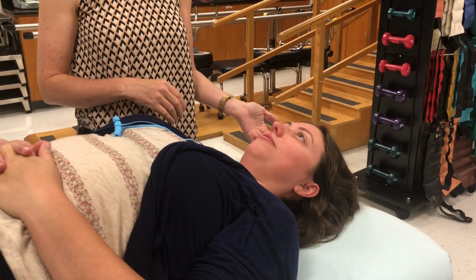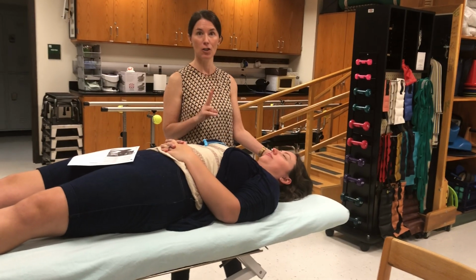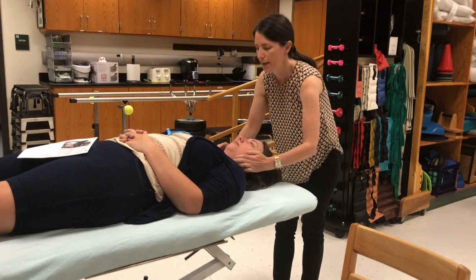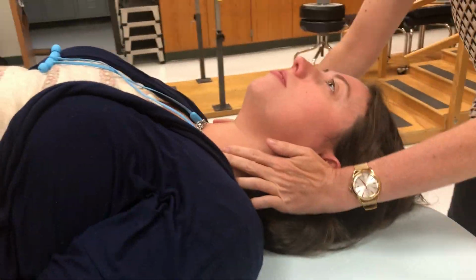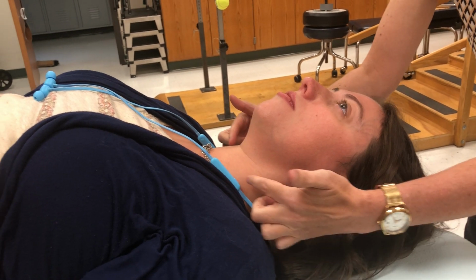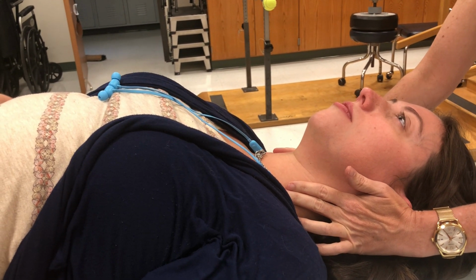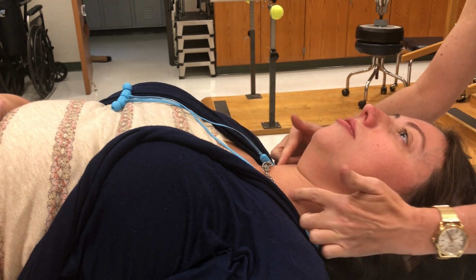If she could only bring her chin up toward her chest like halfway, but not full range against gravity, that would be a grade 2. And if I need to test for a 1 and a 0, I'm gonna palpate along her sternocleidomastoids, and I'm gonna palpate lightly because carotid arteries are here bringing oxygenated blood flow up to the brain, so it's very light. I would ask her to attempt the same motion. Can you bring your head up off the bed? If I see or feel anything, we call it a 1, and if I don't see or feel anything, we call it a 0.